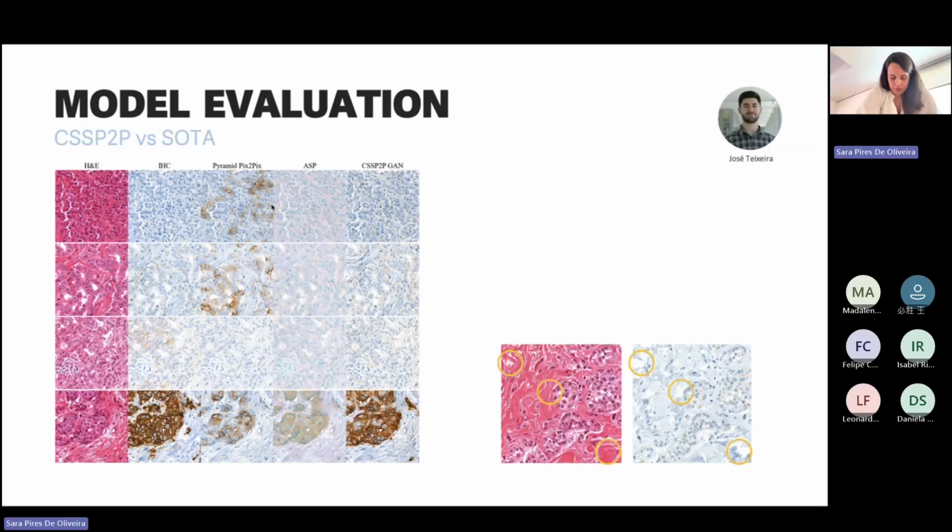And there's one tiny detail that also might partially explain the not so good metrics: even though our staining is performed on top of the H&E, let's say on the same sample, in the lab process there might be some tissue loss. We have the glass slide and we have a cover, and if we have to take the cover off, it sometimes takes a bit of the tissue along with it.